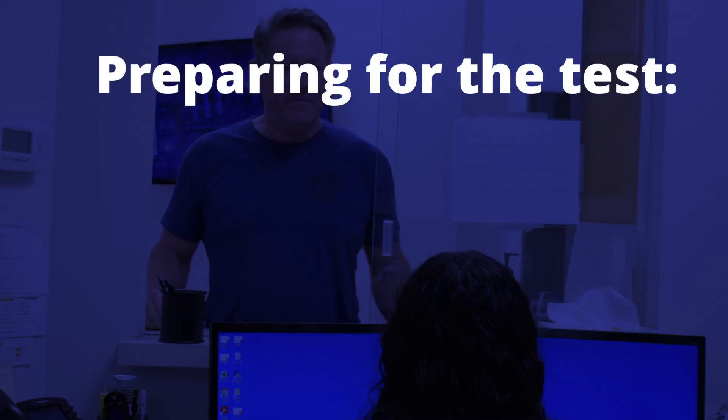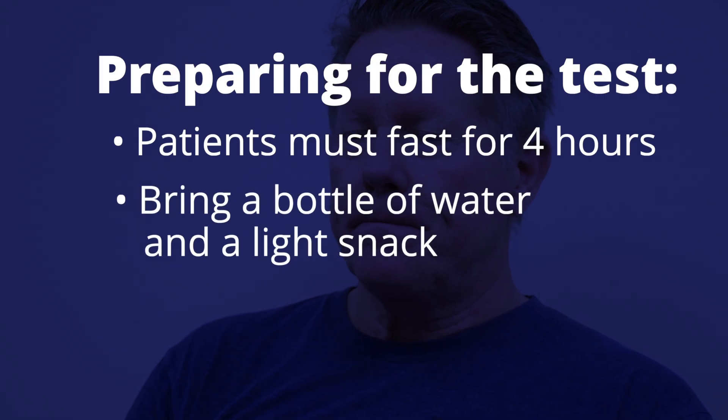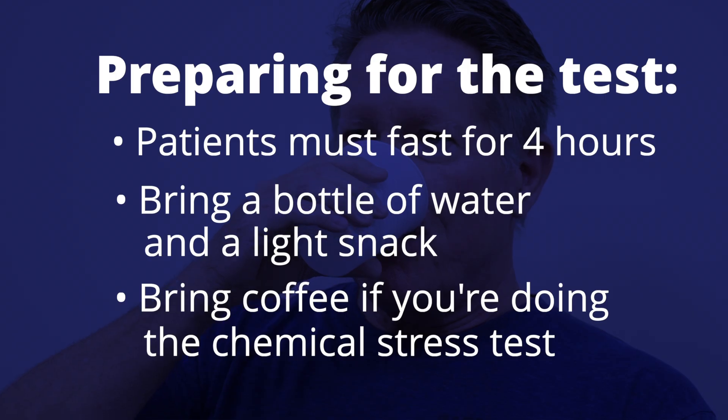When a patient is scheduled for a nuclear stress test at C3, they are required to have fasted for four hours before coming in for their appointment. Patients should bring with them a bottle of water, a light snack, and if you're receiving the chemical stress test, a cup of coffee.